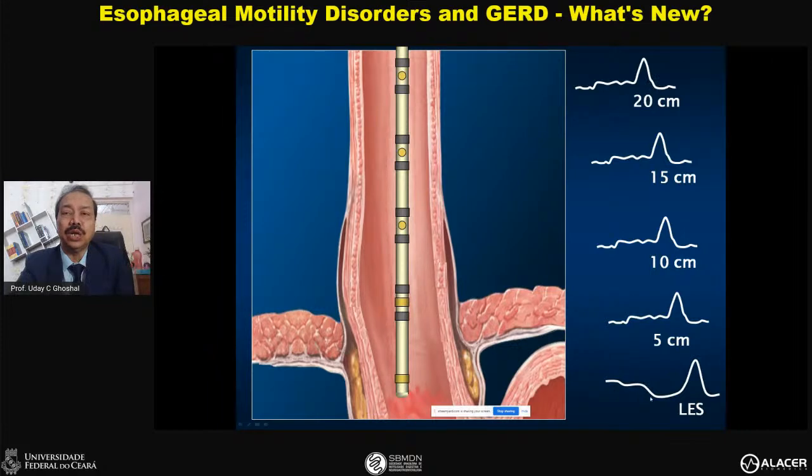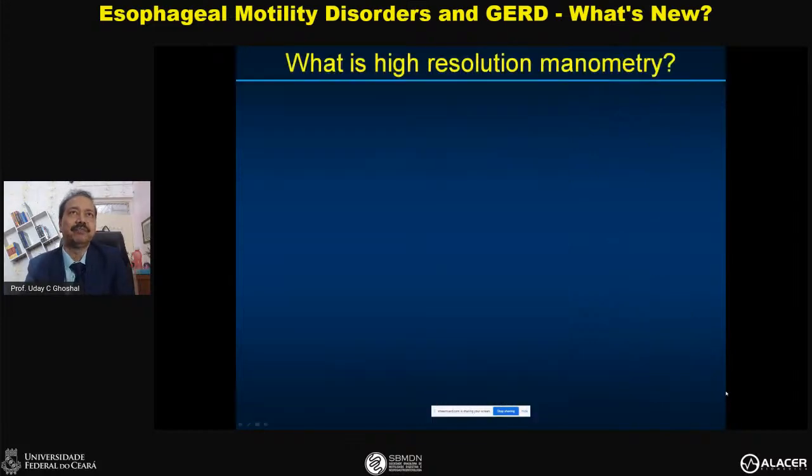This is the lower esophageal sphincter, and as you can see here, when the pharyngeal activity starts, simultaneously, as a reflex activity, the lower esophageal sphincter relaxes, and it remains relaxed till the bolus has crossed the lower esophageal sphincter and entered into the stomach. And obviously, after the bolus has crossed, there is a rebound increase in the pressure, then the LES pressure comes down to the baseline.